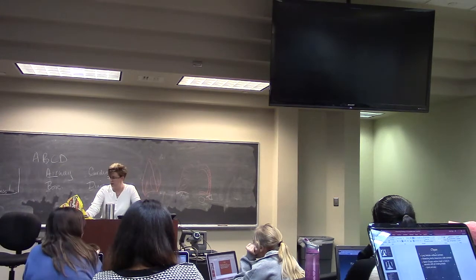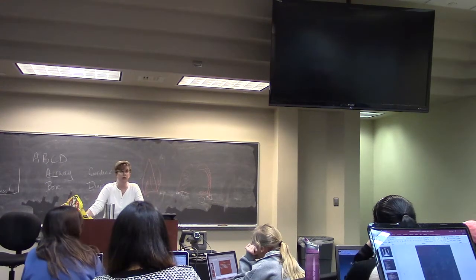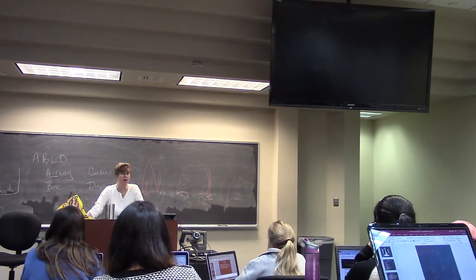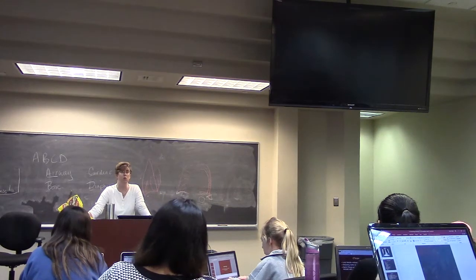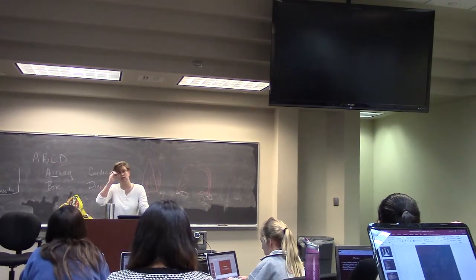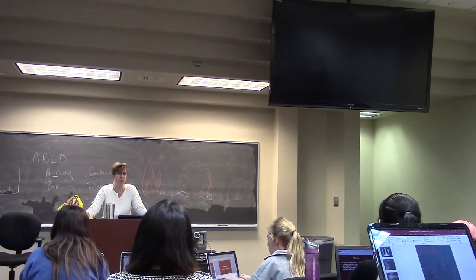So what do you need to know? We have a little lecture after, I have another lecture to go over real quick, it's the silhouette sign, but what do you need to know from this lecture? Well, you better know how to read a chest x-ray. Okay? And I'll tell you why. It's the most used radiograph out there. You will not order any x-ray more than you use a chest x-ray. And you do not have anyone reading your radiographs but you when you're out in practice. It's you.